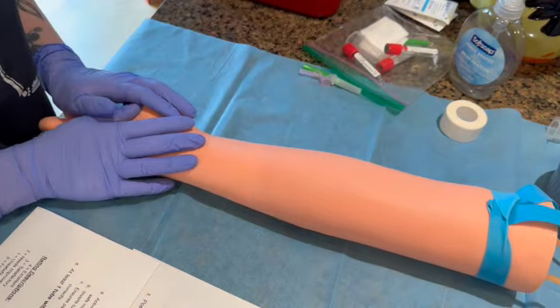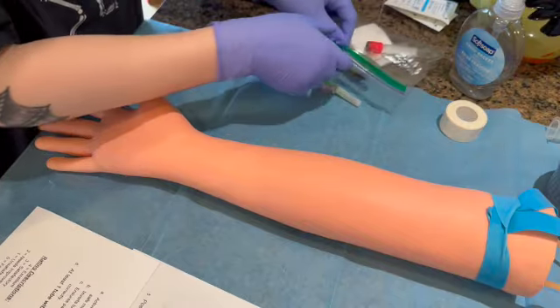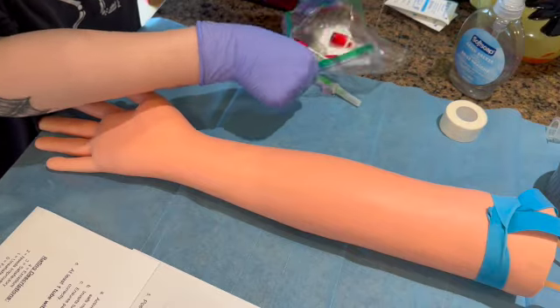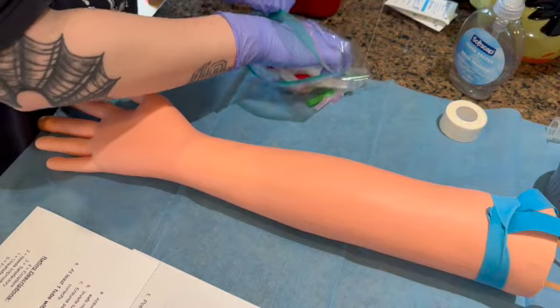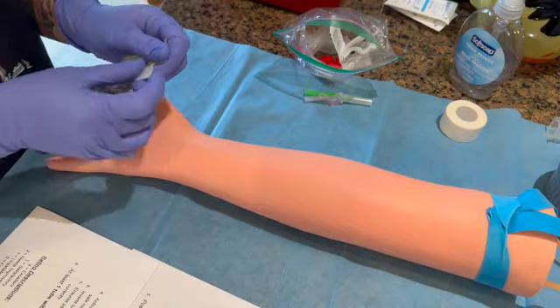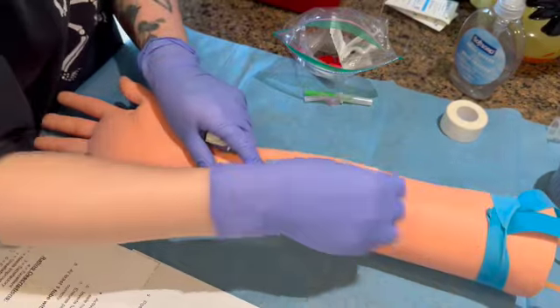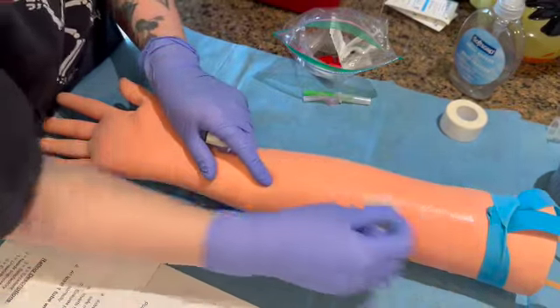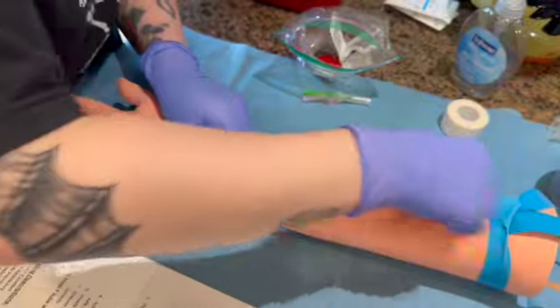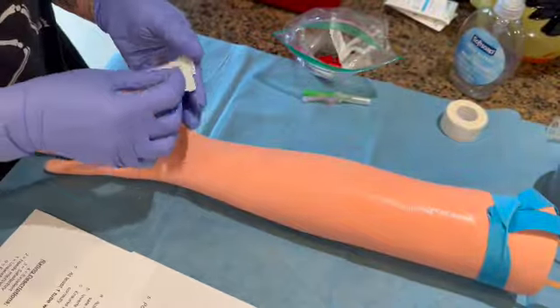And then from here, we're going to make sure that we adequately clean the site. So part of that is going to be getting out our equipment. But for this one, it's just going to be accessing the alcohol, and we're prepping to make a proper antiseptic technique. And we're going to go in and cleanse down Robert here and get him all set up.